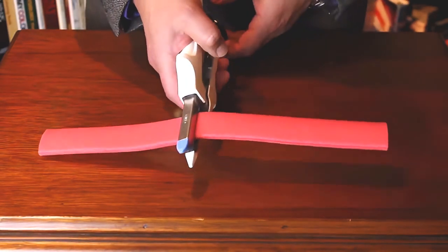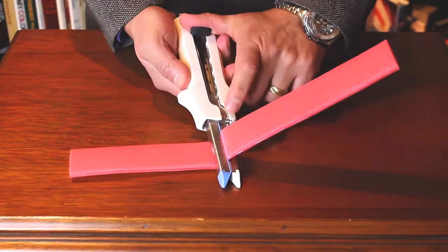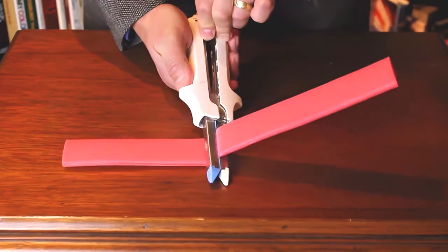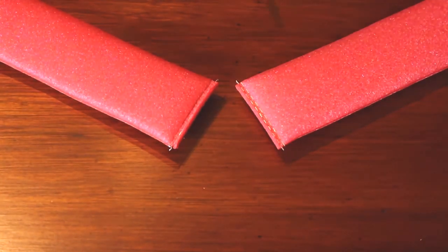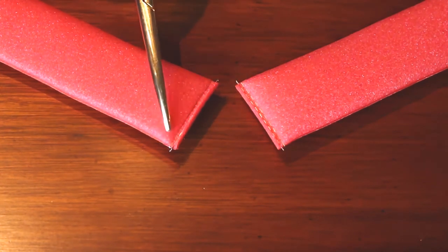We align it, close, fire, open, and you see immediately a perfect transection of the organ, with each side with a line of staples.